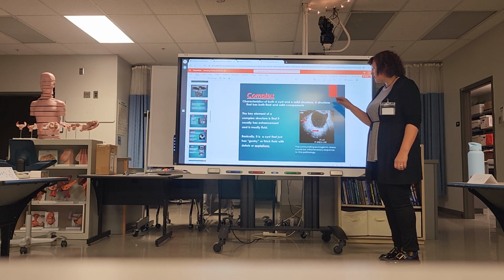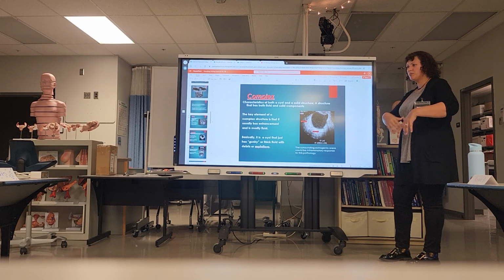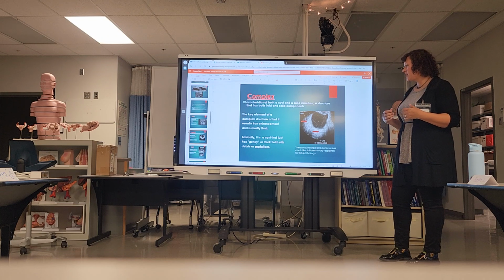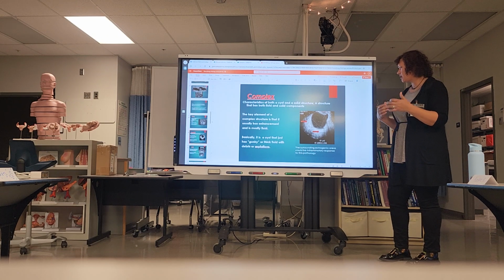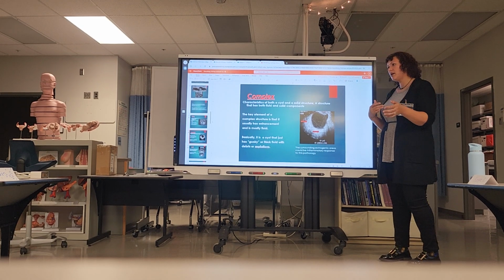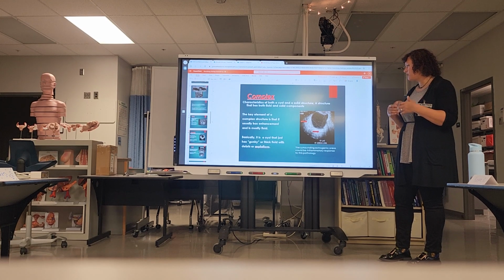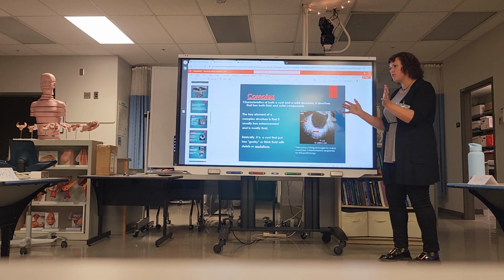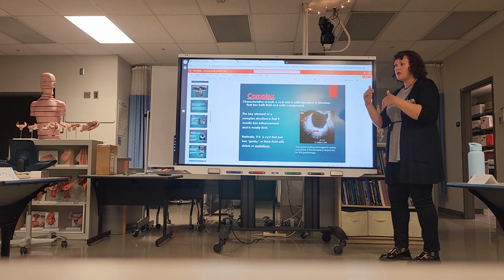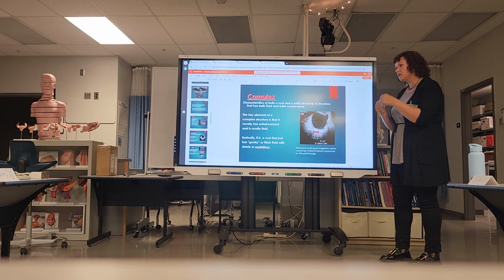So the blood, I mean, we see blood all the time, loose blood, blood that's not within the vessels. And it takes on different characteristics depending on its age. So you guys will have more of that later on. But when blood first appears somewhere, it's going to be anechoic, and then after it sits for a while, it becomes more echogenic, and then it finally starts to kind of break down.